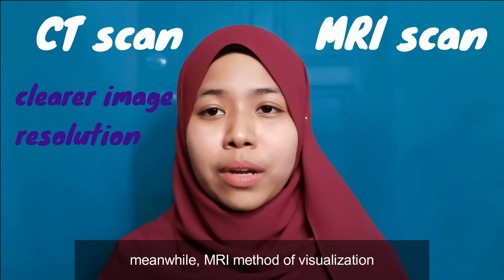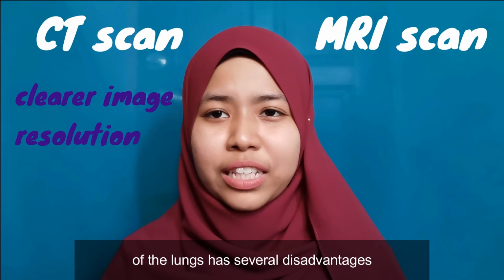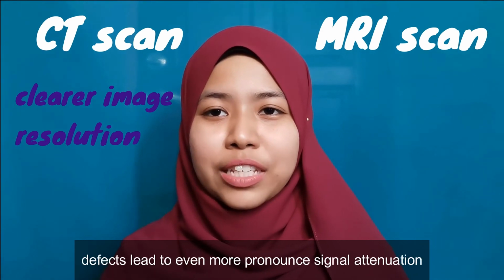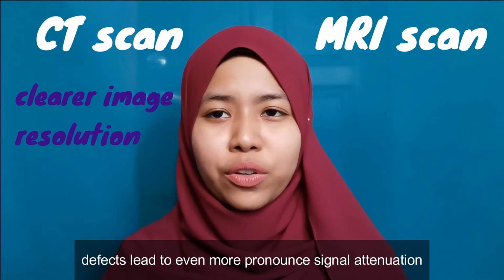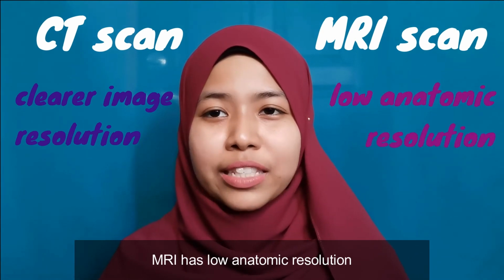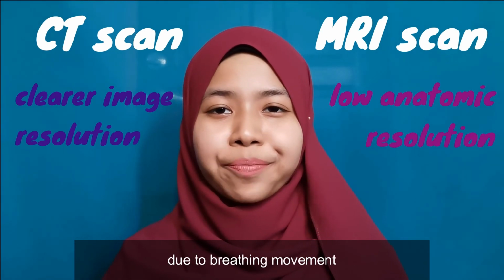Meanwhile, the MRI method of visualization of the lungs has several disadvantages. In addition, susceptibility effects lead to even more pronounced signal attenuation. MRI has low anatomic resolution and is compromised by inevitable artifacts due to breathing movement.